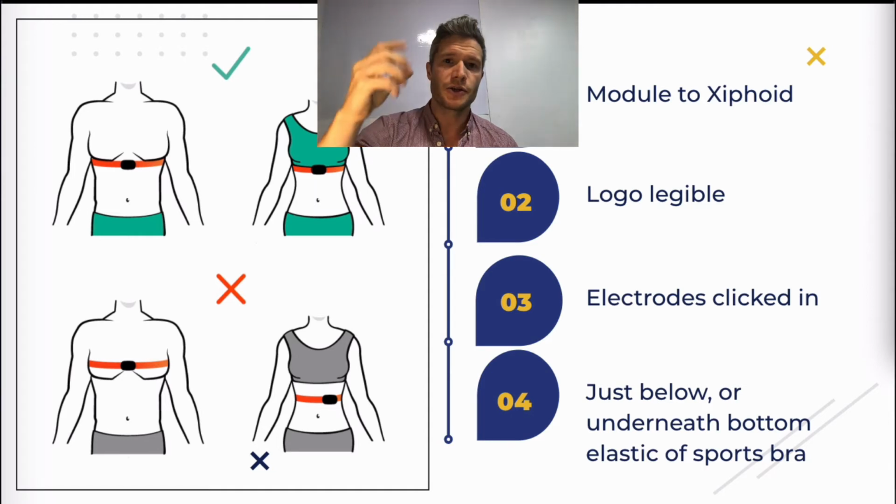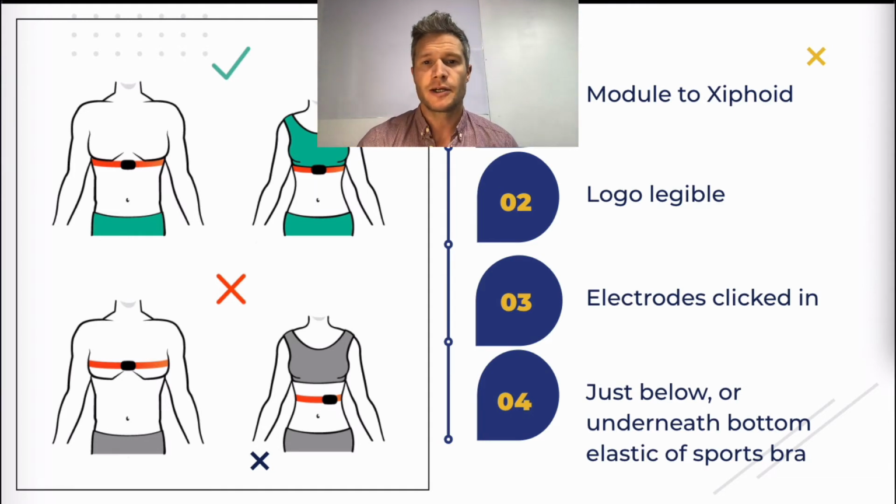So a nerve pulse goes and the heart contracts. What that means is these electrodes pick up every single time that electrical signal is sent. So it knows quite accurately exactly when the heart is beating because of the electrical pulse, and it picks it up quite directly.